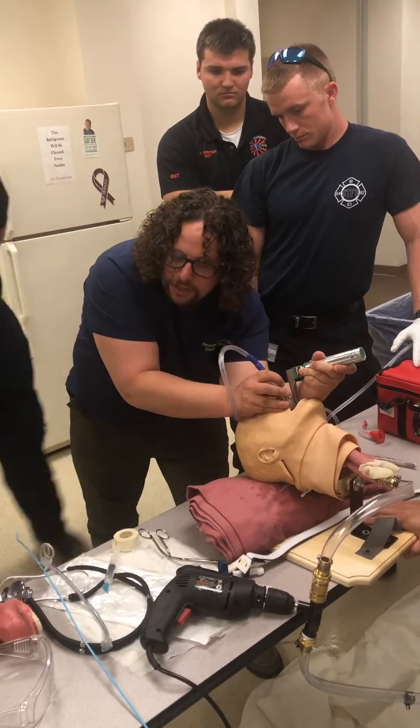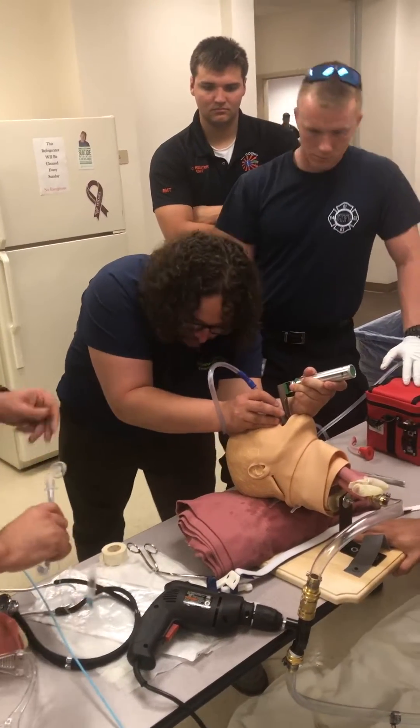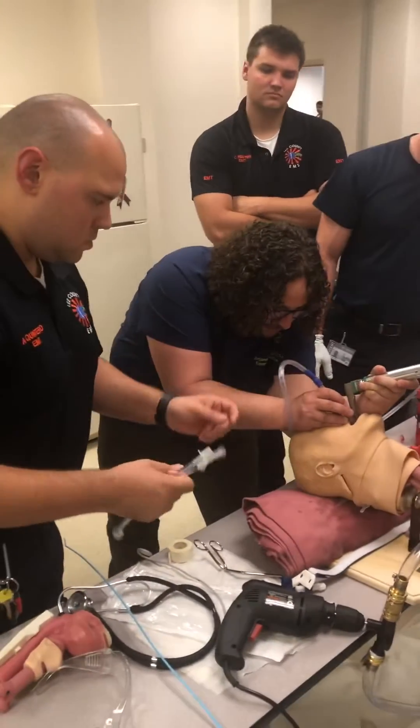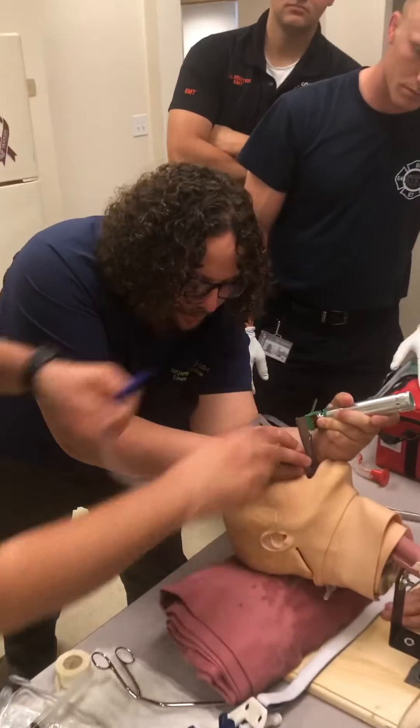In here — take the stylet out of there, please. Take the suction catheter off. So the tip of that suction catheter is in the glottis — pull it. He's dying.